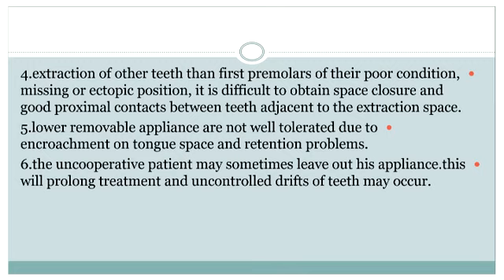Number 5, lower removable appliances are not well tolerated due to encroachment on tongue space and retention problems. Very uncomfortable for the patient, really, because the movement of the tongue is restricted. The pronunciation is very, very difficult for the patient.